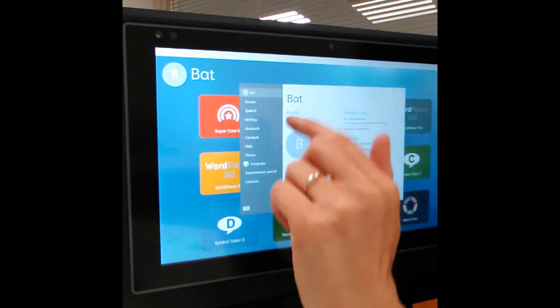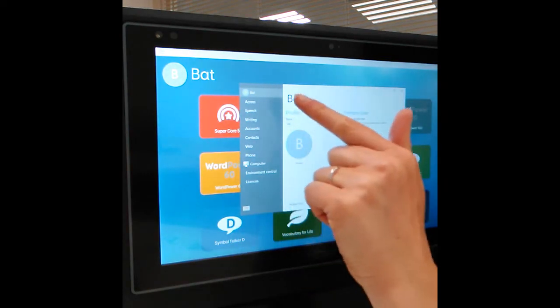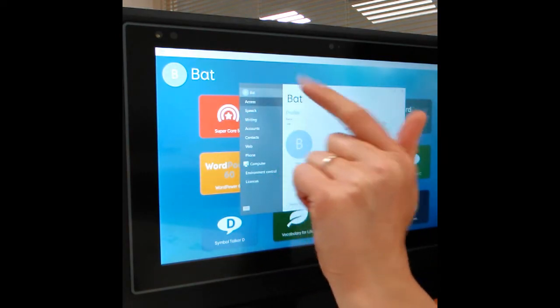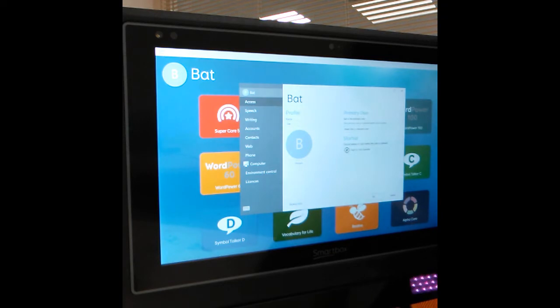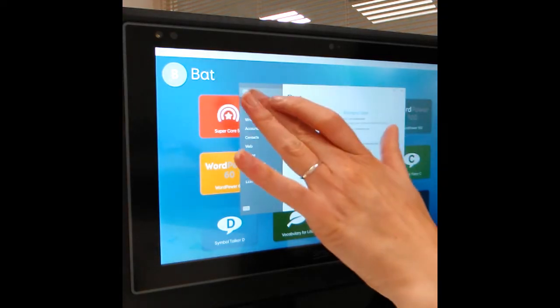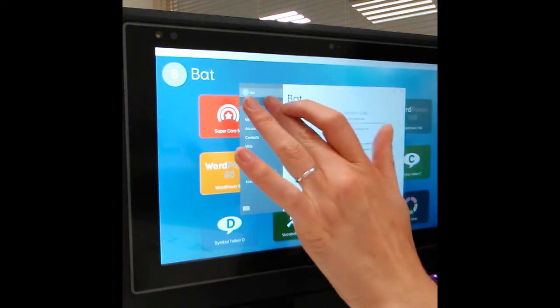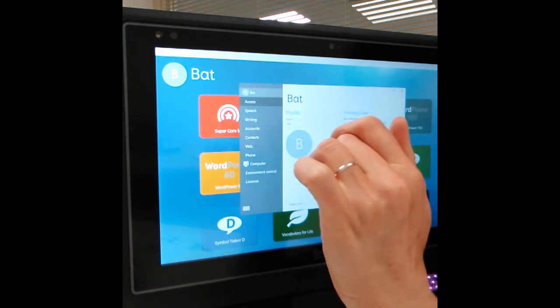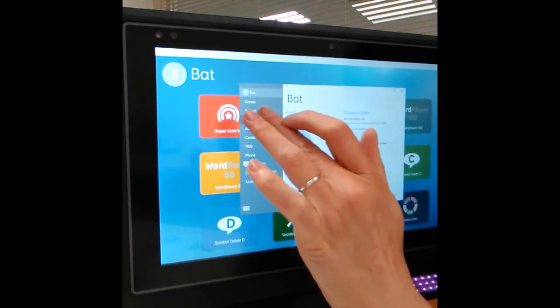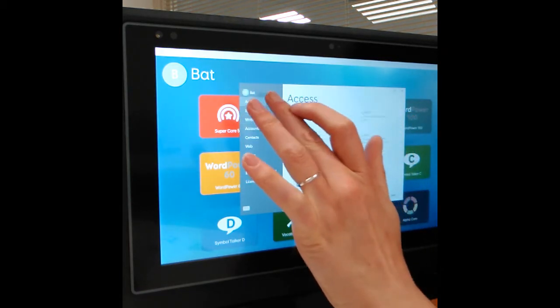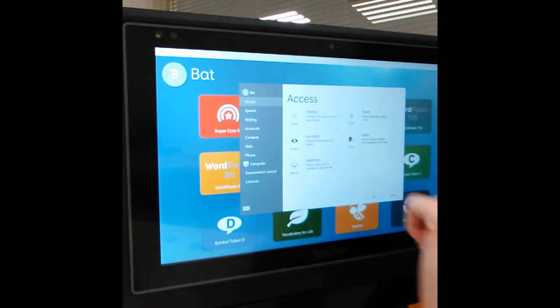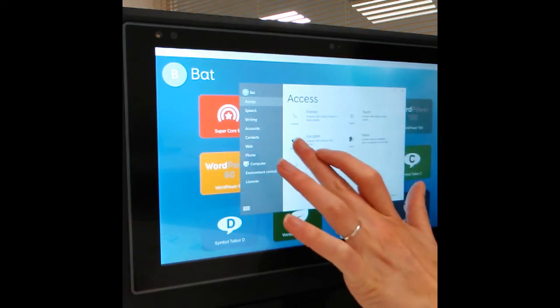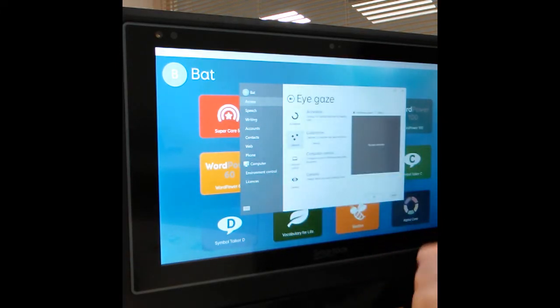What we should be able to do is then go down to Access on the side. That's it, into Access and then Eye Gaze.